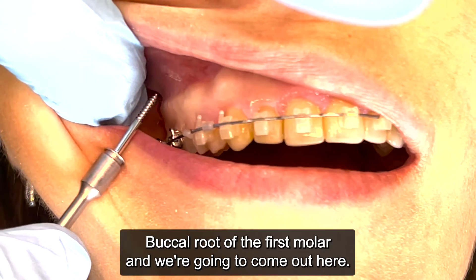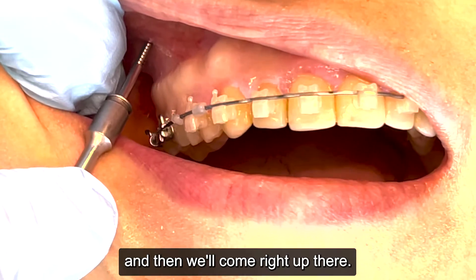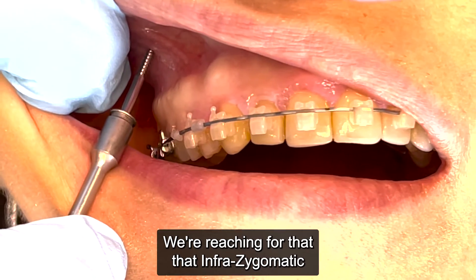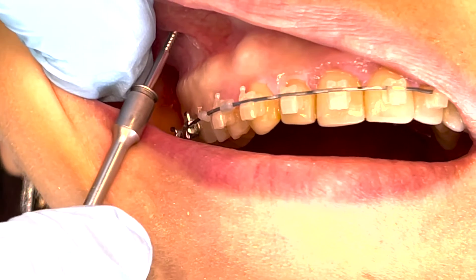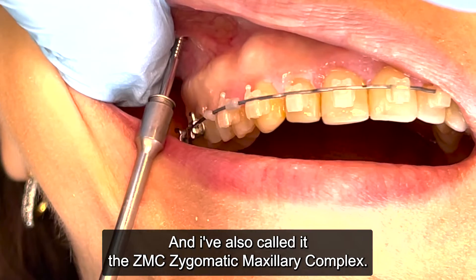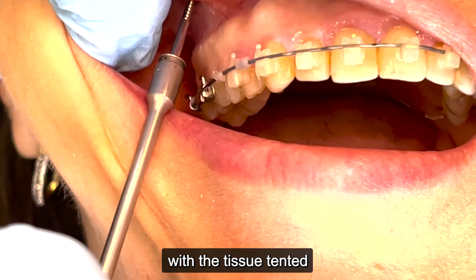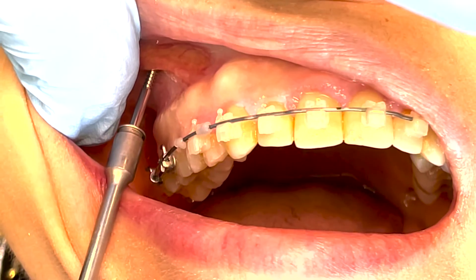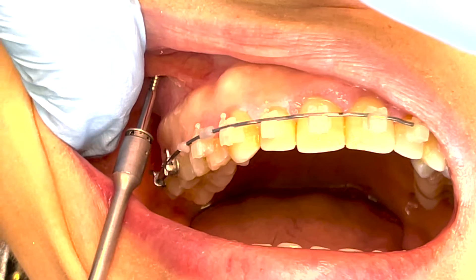We're going to stretch the tissue out and come right up there — we're reaching for that infra-zygomatic crest, or IZC. I've also called it the ZMC, the zygomatic maxillary complex. We're just going to go straight in here with the tissue tented.